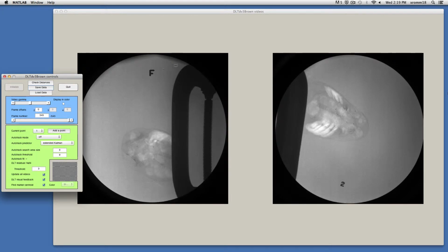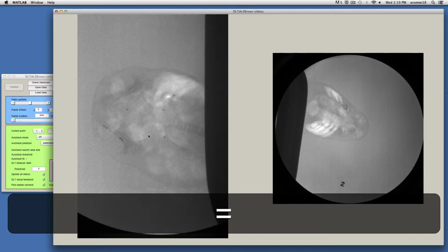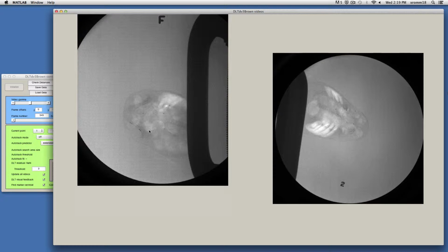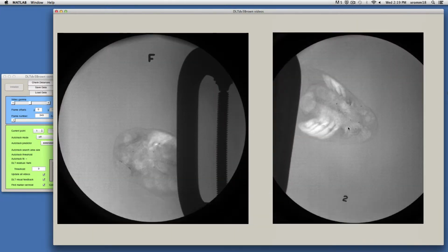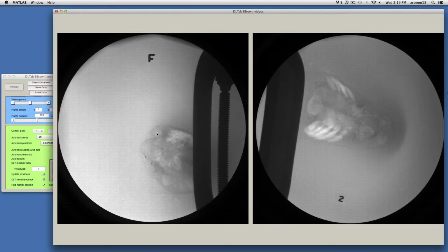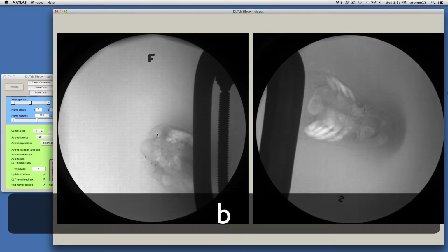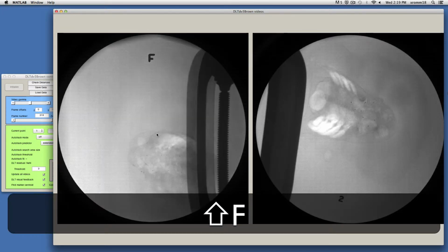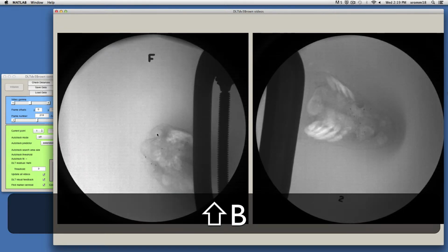I'm going to quickly cover a few shortcuts that will make digitizing much easier. If I select the viewer window and then hover the mouse over anywhere in either viewer, pressing the equals and dash keys will make the video zoom in and out, centered around the cursor. Pressing R will return the video to a full view. If I press F, the video will move forward 1 frame, and if I press B, it will move back 1 frame. Holding Shift and F or B will make the video jump 50 frames forwards or backwards. You can find a longer list of shortcuts on the XROMM wiki.